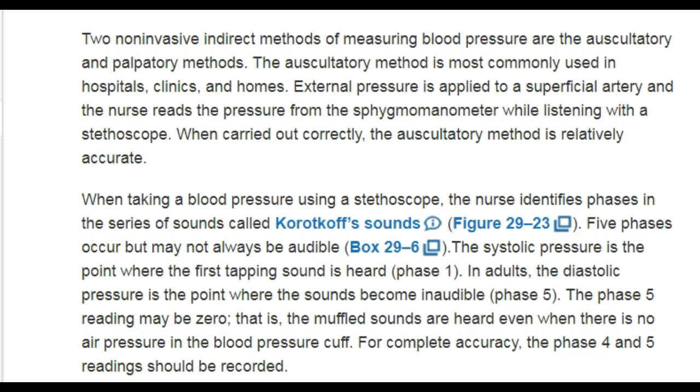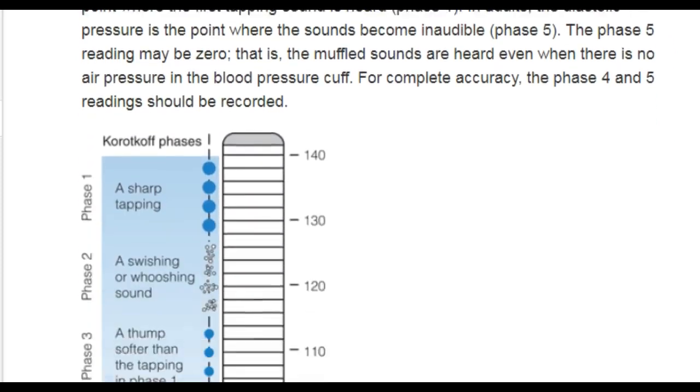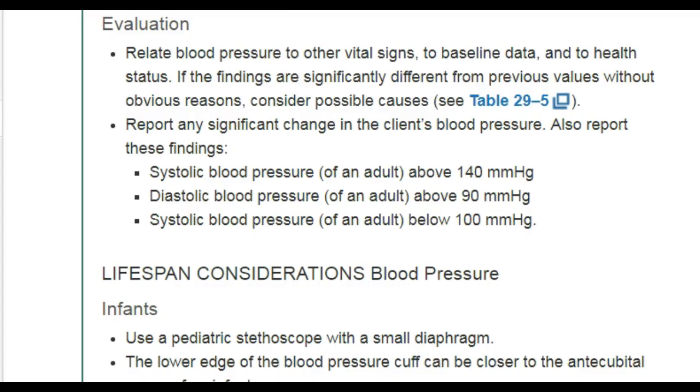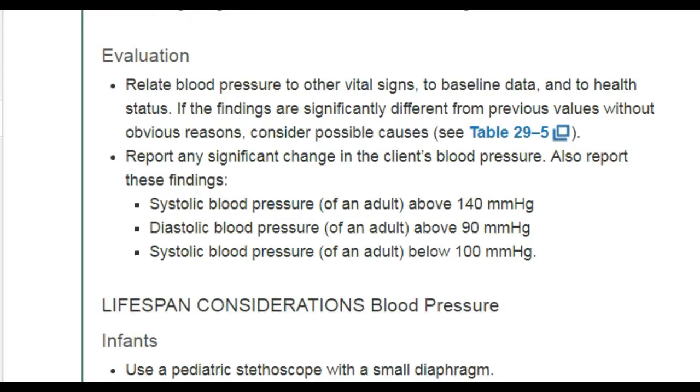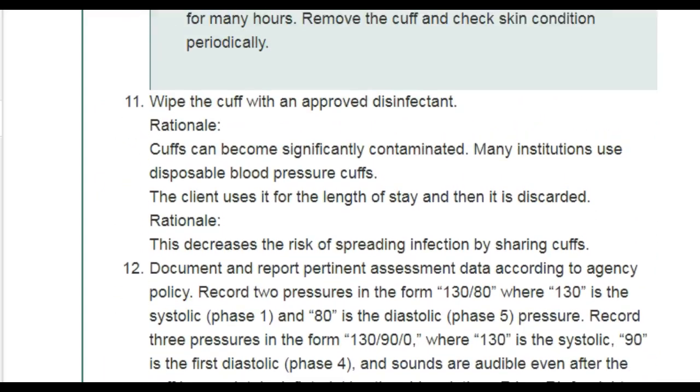And also, I didn't mention earlier, but I want you guys to make sure that when you're taking the blood pressure, it's at the heart level. Legs uncrossed and patient not speaking. Most patients in the hospital now have the disposable blood pressure cuff. But if you are in a place where they don't, make sure for infection control we're wiping the cuff with approved disinfectant.